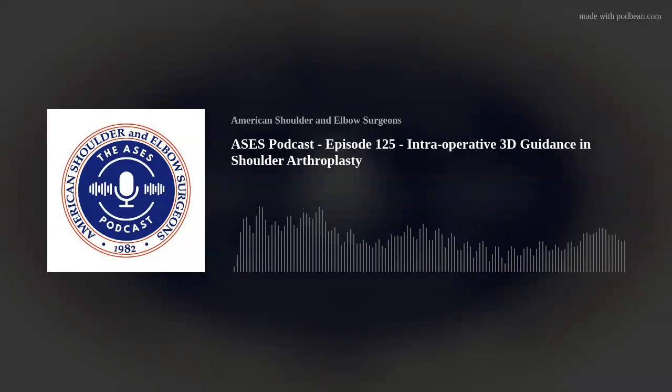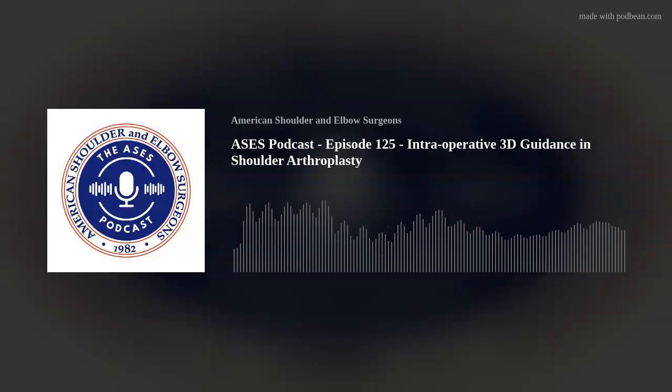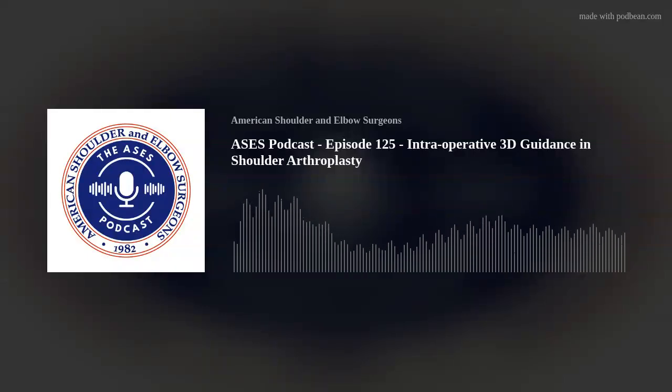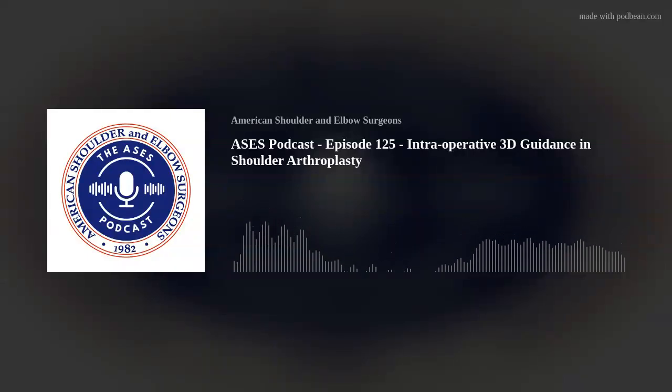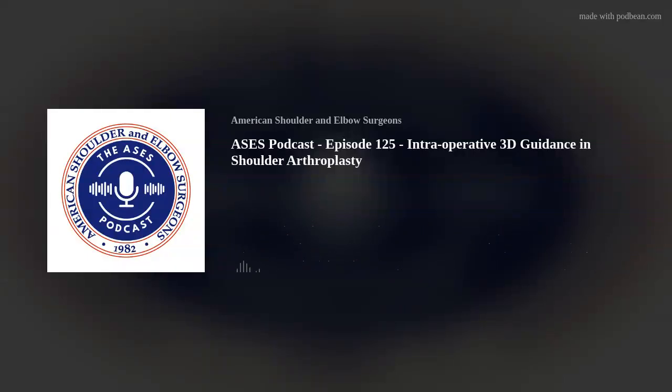In terms of humeral torsion, which we haven't spoken about, I do 20 degrees of torsion generally, but there will be the odd patient that's really way off. I think Philip Moroda's work is making me think a bit more about that with some of my patients with regards to their scapular position, and that's something we're working on in our lab as well. I'm getting the feeling that Philip's idea of retrotorsion having an effect with regards to scapulothoracic motion, stiffness and positioning is probably relevant. So I'm thinking about it a bit more, but obviously we need more evidence.